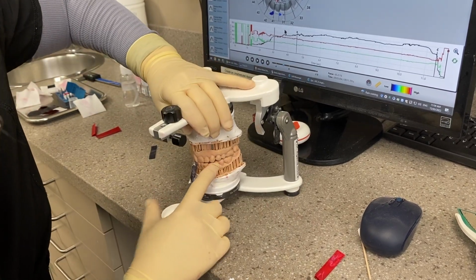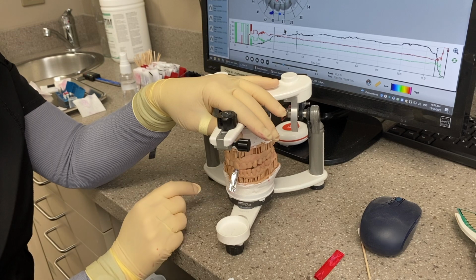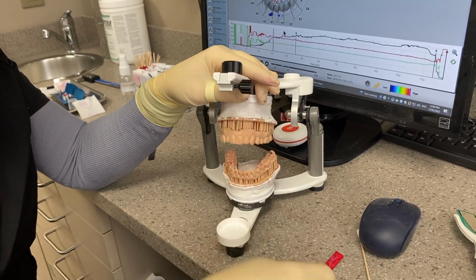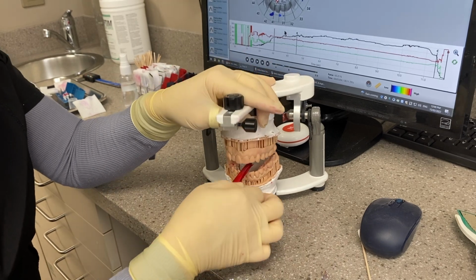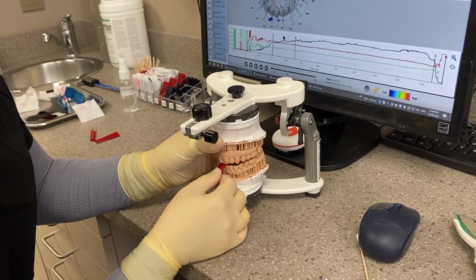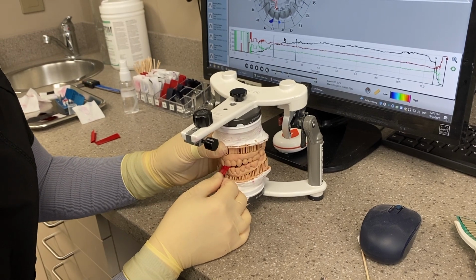So in order to get her on the canine here, we have to reduce in the front, because she's driving sideways on that front tooth. So I am going to adjust it down a bit more, because I do see the potential of putting her in canine guidance here, which would be lovely.